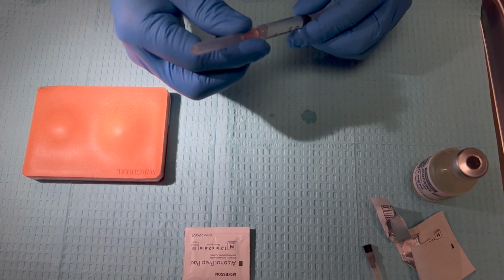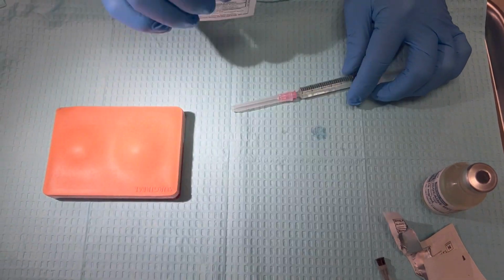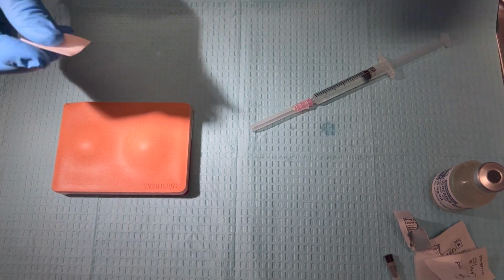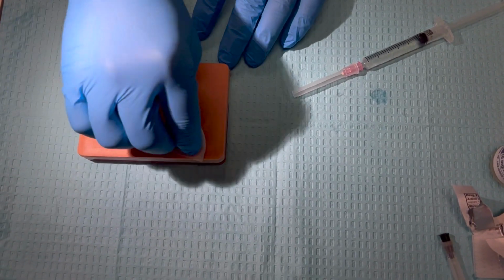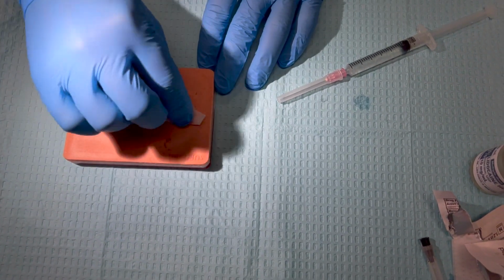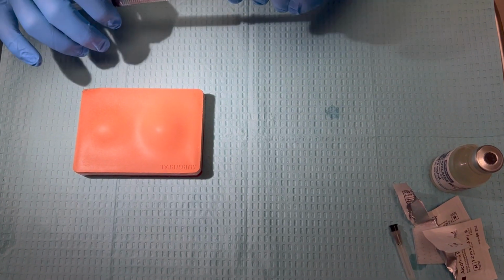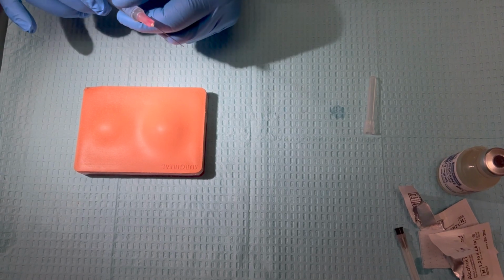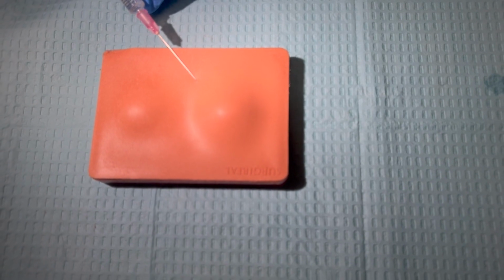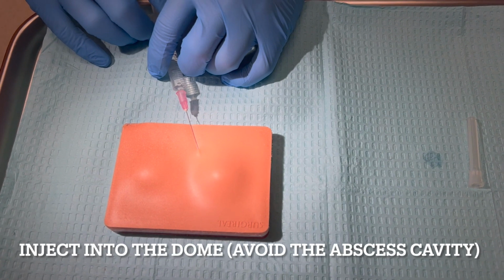I'll now put on the smaller needle, usually a 25 gauge, though a 27 gauge can be used. Before I inject this into the area, I want to first prepare the skin, in this case with another alcohol pad. I'll clean the area, and again, we want to allow for drying of that alcohol prior to injecting that medicine. Now that we have prepared the skin with alcohol, I'll go ahead with bevel up, and we want to come in very superficially into the area, being mindful not to inject the medication into the abscess cavity itself.